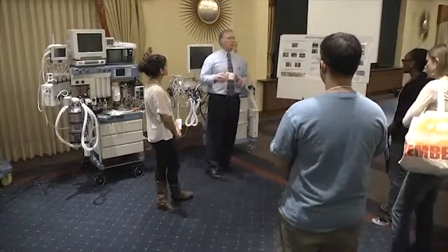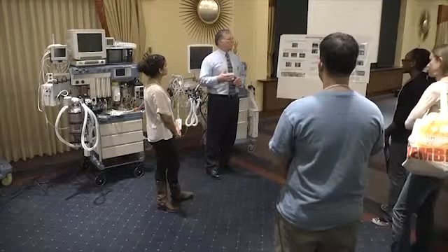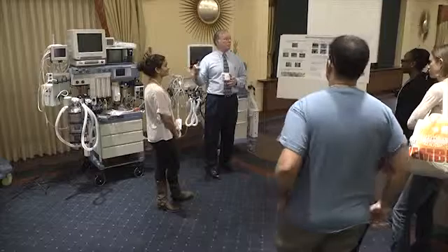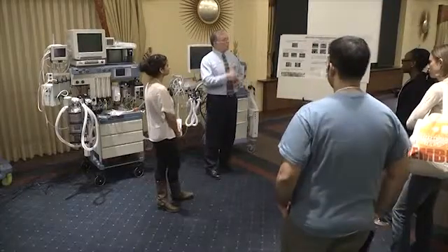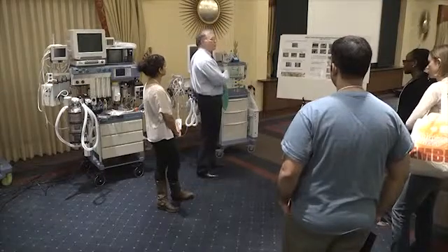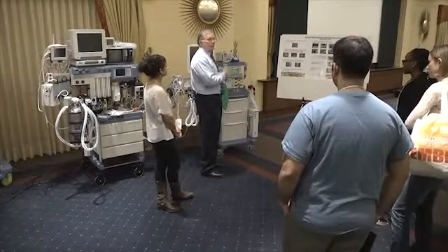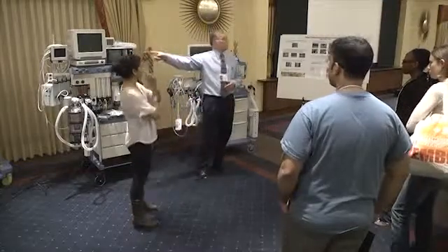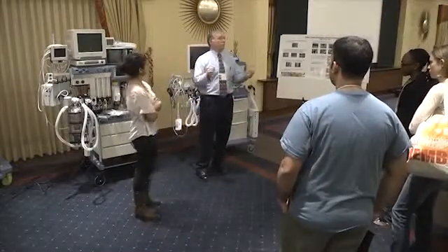Because how many times do you lose power to your hospital? It doesn't happen that often, although it does, and especially if you go on mission trips, it does. But what happens more than losing power to your facility is losing power to your machine. I've had several machines. In fact, the Apollo machine, it's a brand new machine. I've already replaced 4 power supplies on those. So all of a sudden you can lose all the power of your machine.